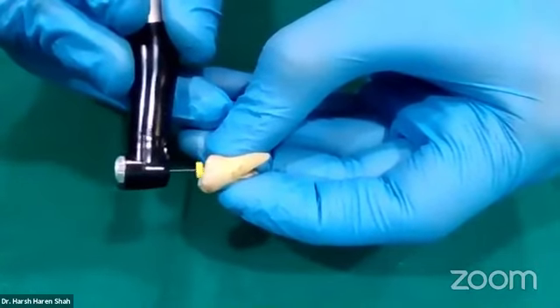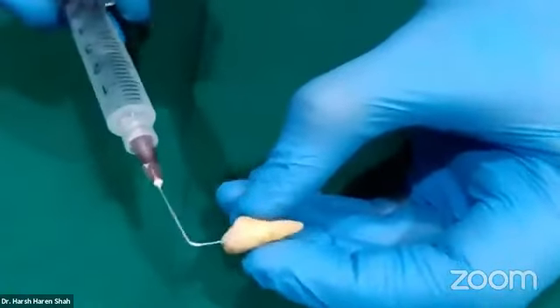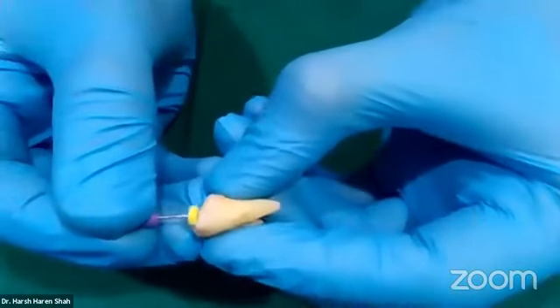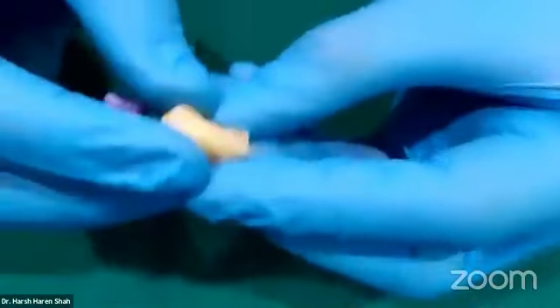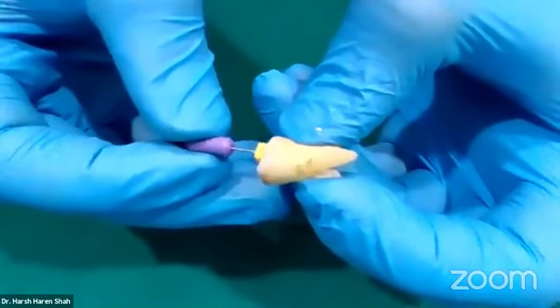So if you are using a dedicated rotary glide path file, glide path preparation is so simple. We will irrigate once with hypo. We will take our same good old 10 numbered K file. Oh, it goes so smoothly till the full working length now, which means glide path preparation has been satisfactorily achieved. So that is where you can see it is going to the full length very easily.